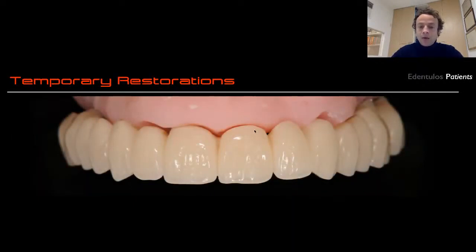And you can see how we have a dental bridge. So we don't have pink reconstruction. We don't have a hybrid solution, but this is a dental bridge. And this is important to work in this way when we have the possibility to work creating a dental bridge, because in that way my prosthesis can immediately sustain the soft tissue.